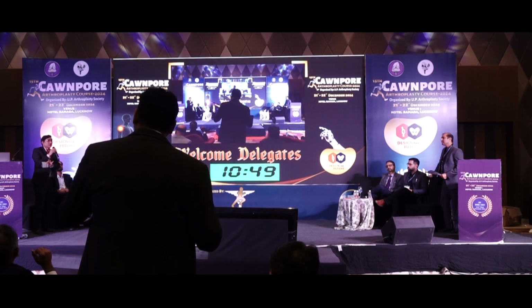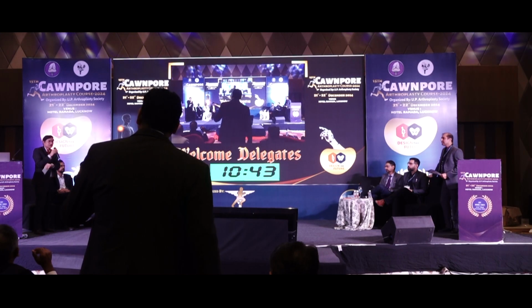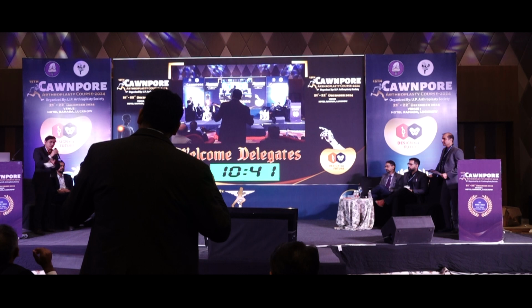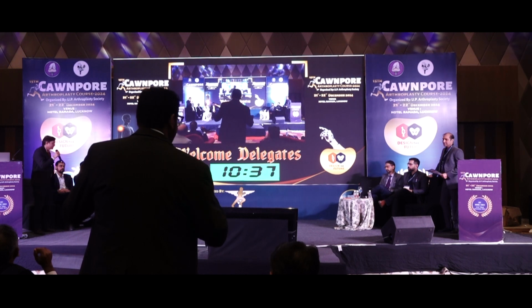And as a rule, for many years now, in all our hip cases, before the patient is shifted out, he is always seen in the image. A simple hip, complex hip, whatever it is. So there is always a shot which is taken before the patient is taken out of the theater.